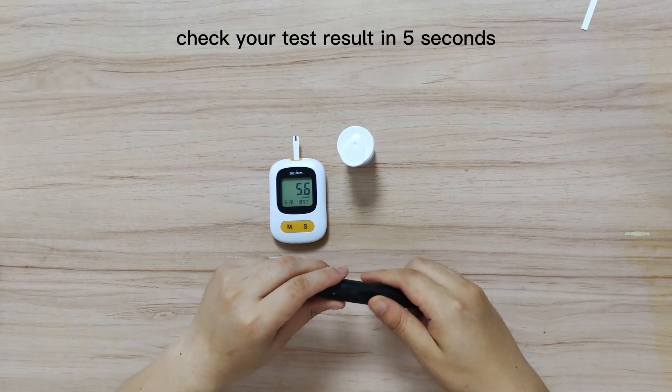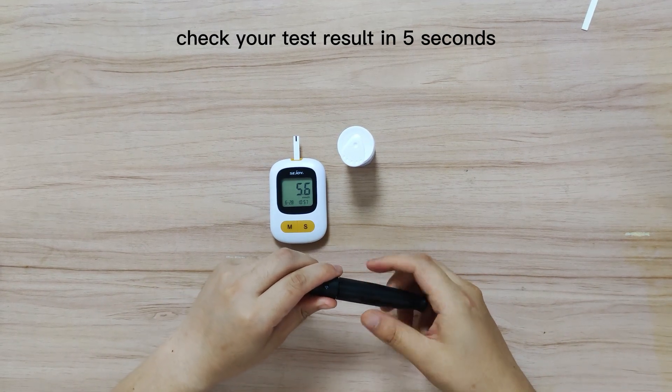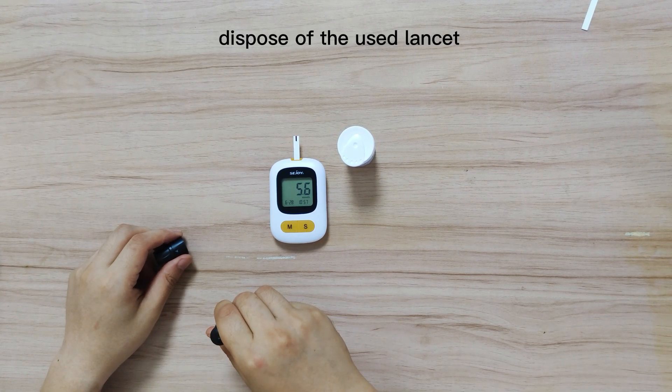Tests will be automatically stored in your meter. Safely dispose of the used lancet.